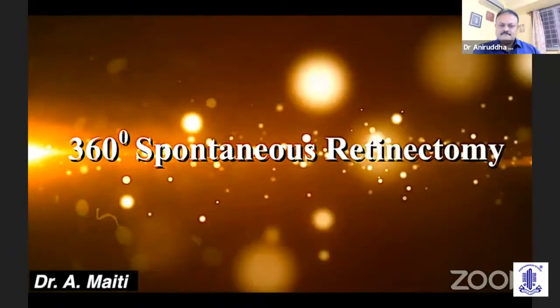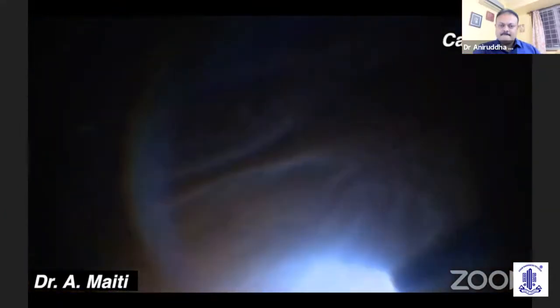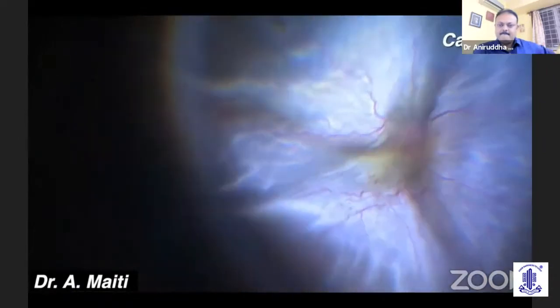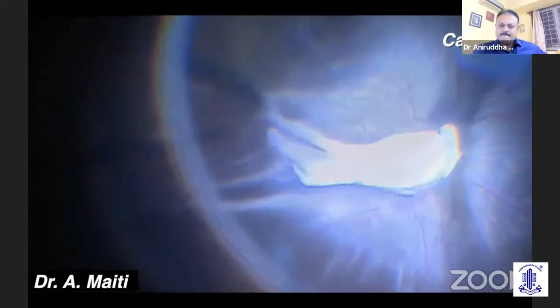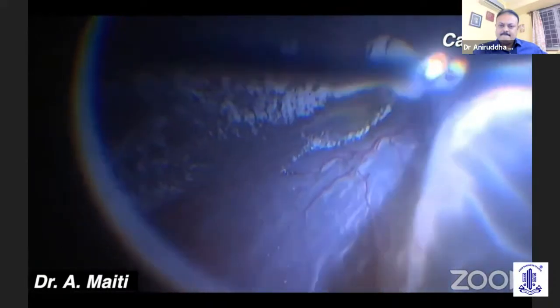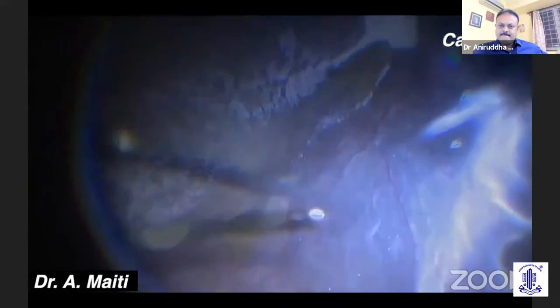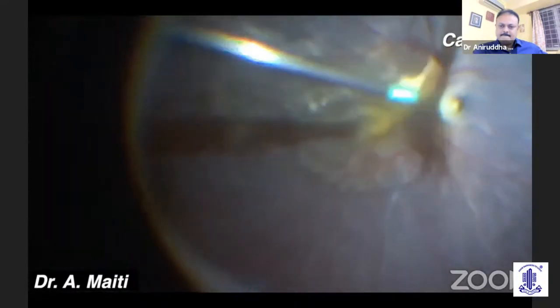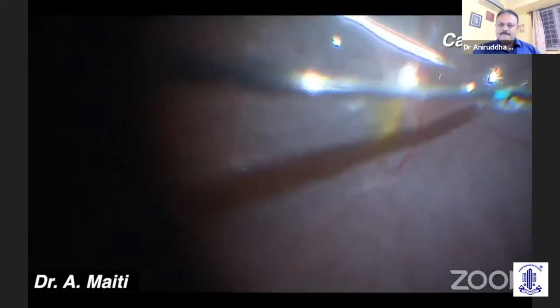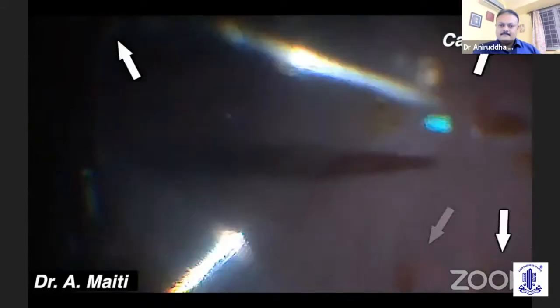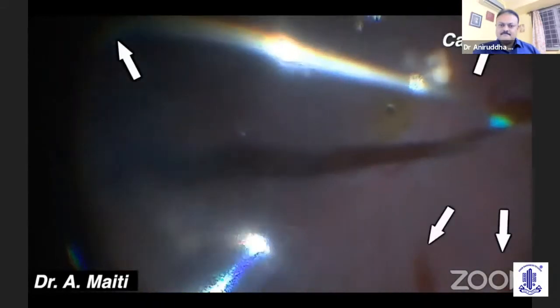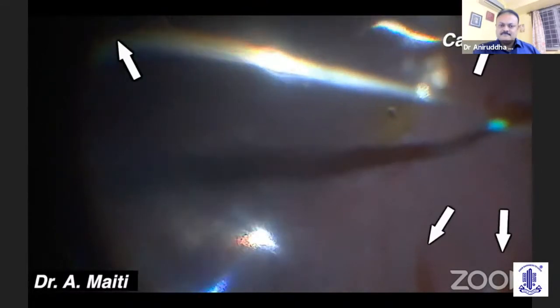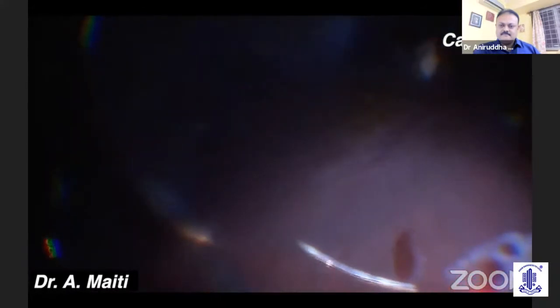The second case was an old retinal detachment with PVR changes. After core vitrectomy, triamcinolone acetonide was injected to stain the vitreous, and the peripheral vitreous was then taken care of. A nasal retinotomy was done to release the thick subretinal fluid. But while performing a fluid-air exchange, a rare complication occurred: all quadrants had a series of spontaneous radial retinectomies and the retina settled. Laser was done around the retinotomy, the primary break, and the series of retinectomies.